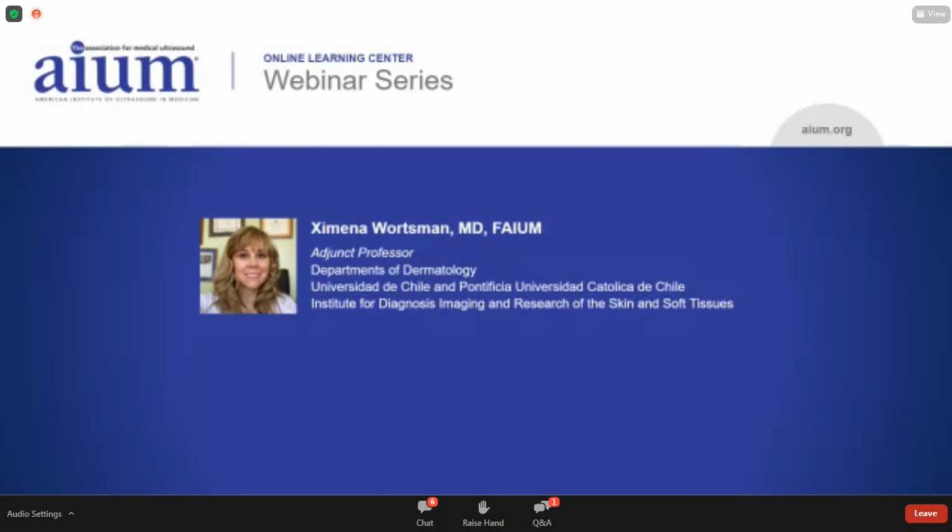Another question is, which vendor has this 70 megahertz probe? I don't know if I can say that, Ashley. No, unfortunately, we can't.